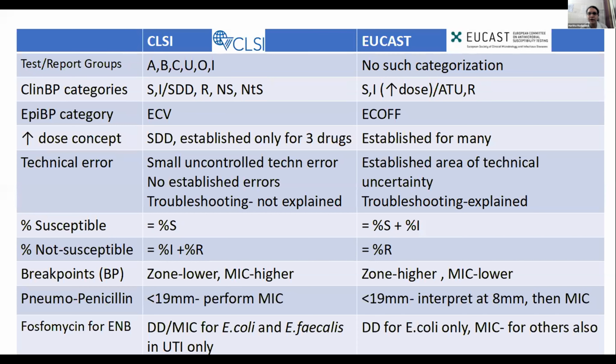So can anybody of you tell me, recollecting yesterday's session, for which SDD is present? Ceftaroline. Yes, cefepime. Cefepime for Enterobacterales. Very good, daptomycin. Yeah. So for these 3, a susceptible dose dependent concept is given according to CLSI. But according to EUCAST, there are many drug bug combinations for which this increased dose concept is given.